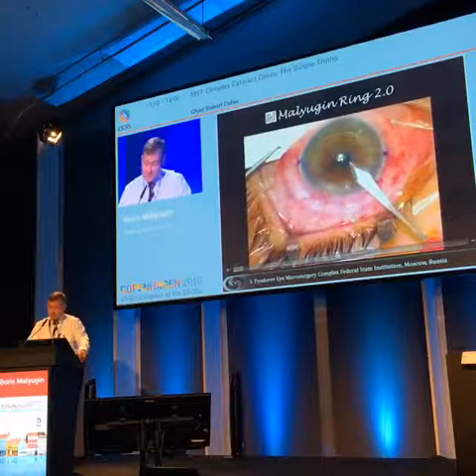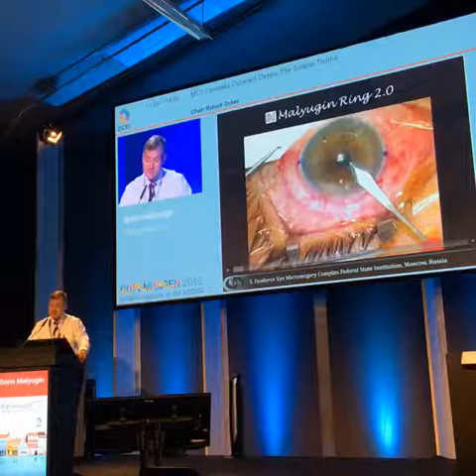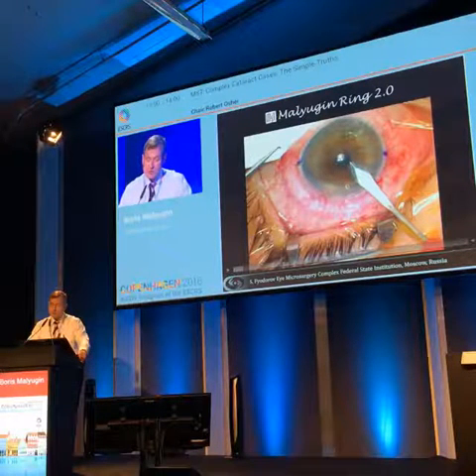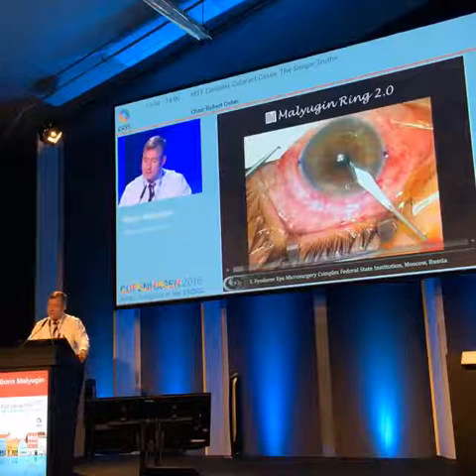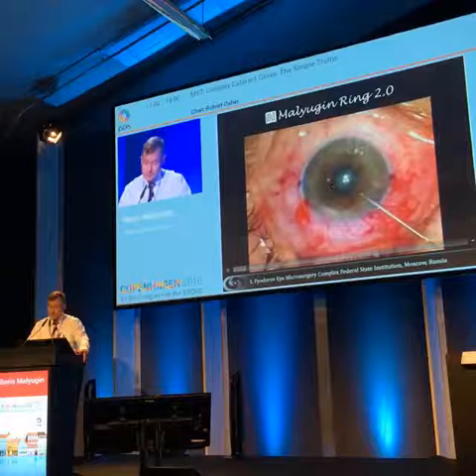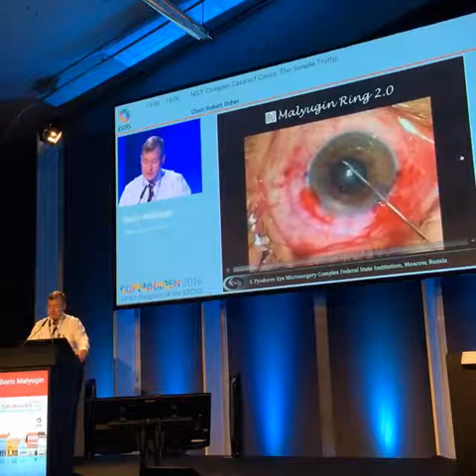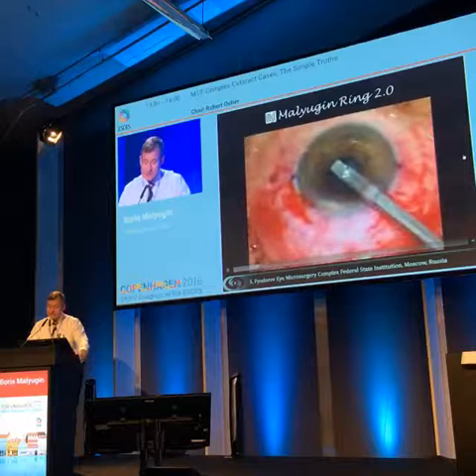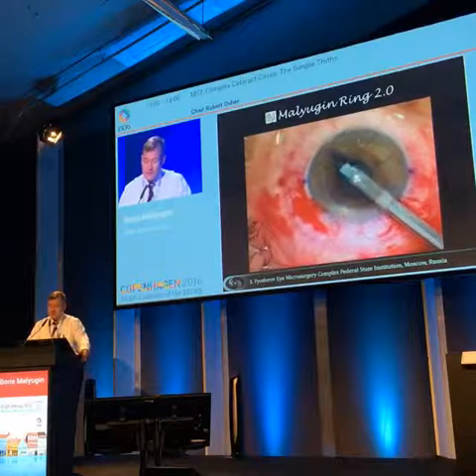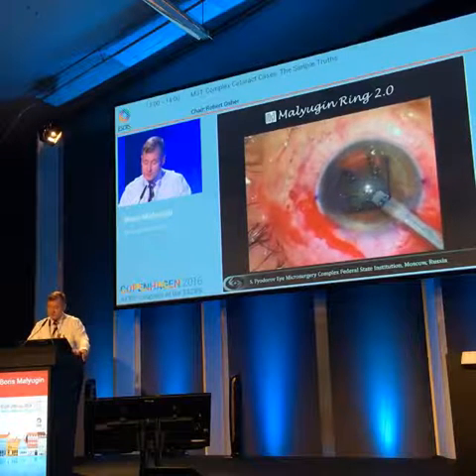So I was actually playing with different variations of lasers, and this is a patient that came to me from the laser. You see, the laser was already done. This is a patient with a corneal transplant, where I was planning to implant a custom-made IOL, and as you can see here, the pupil is very small. It was possible to enlarge it a little bit by utilizing intracameral phenylephrine and heavy OVD, but still the pupil is not enough to proceed with the surgery.